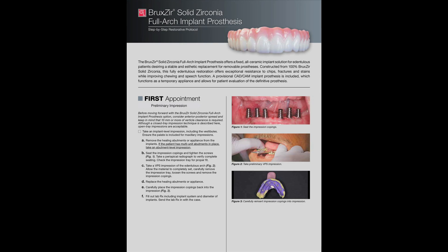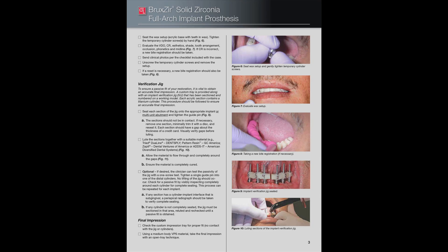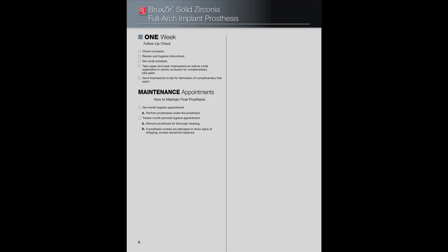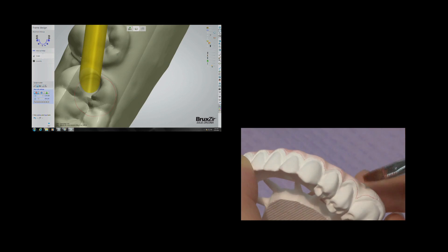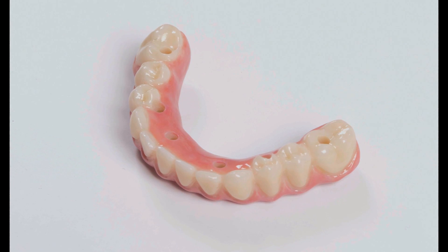The sequential workflow that follows outlines the process of designing and manufacturing the Bruxer Solid Zirconia Full Arch Implant Prosthesis, providing a step-by-step restorative protocol from the lab's perspective. The fabrication process combines CAD-CAM technology and traditional laboratory techniques to produce a durable, aesthetic, and well-fitting prosthesis.